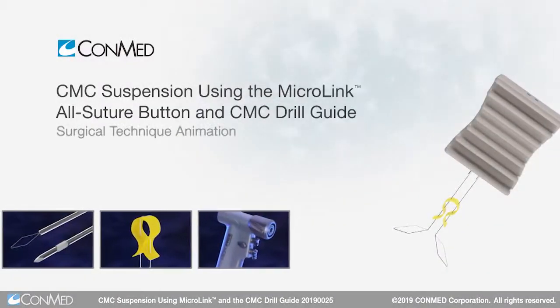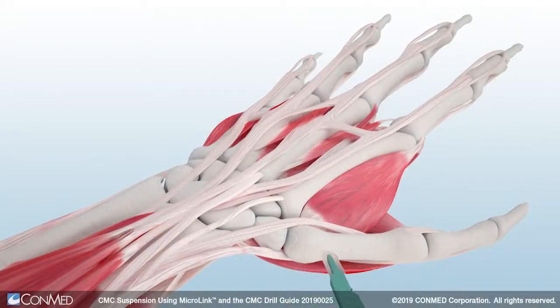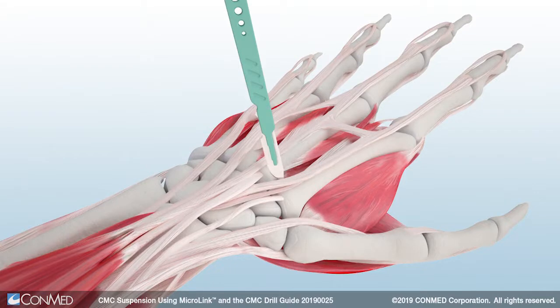To begin the CMC suspension procedure, first make a volar incision centered over the carpometacarpal joint located along the glabrous skin edge. A second incision is made at the base of the second metacarpal and dissection is made deep to the thenar muscles.